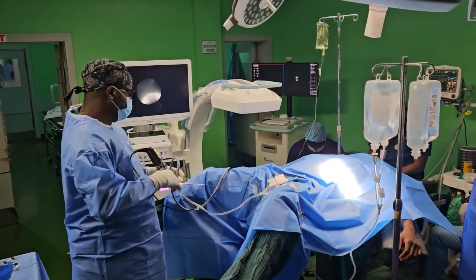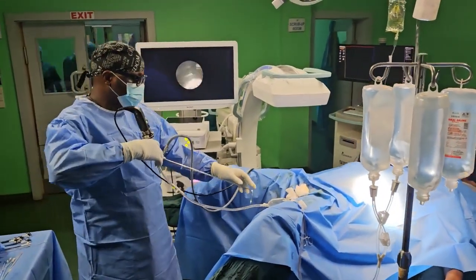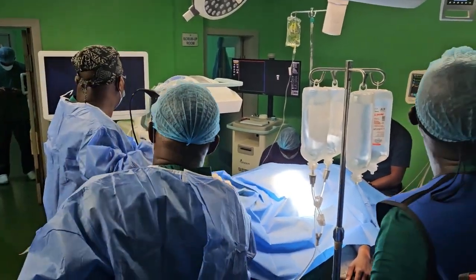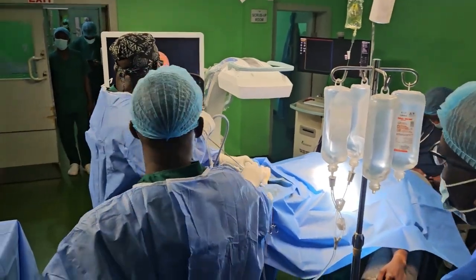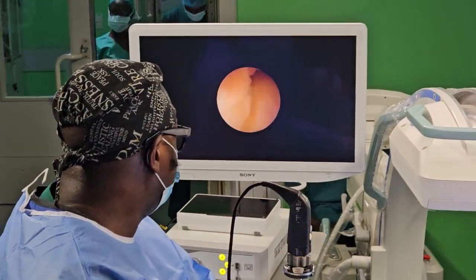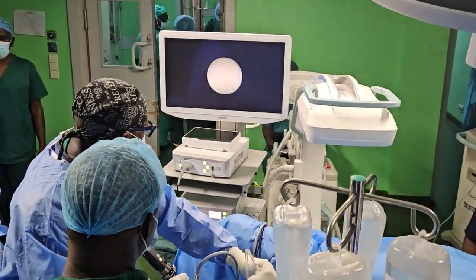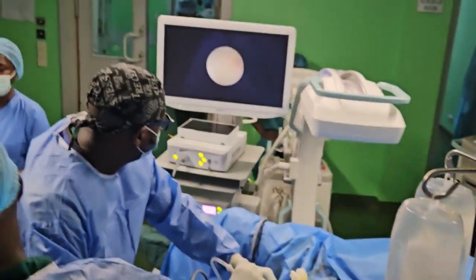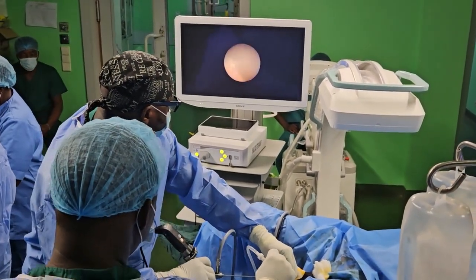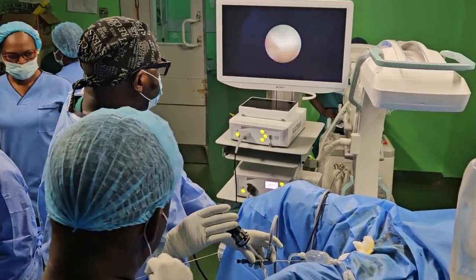There are so many people around. Hello, come so that you can see. Can you see the stent? No stent. The two prongs and then one.